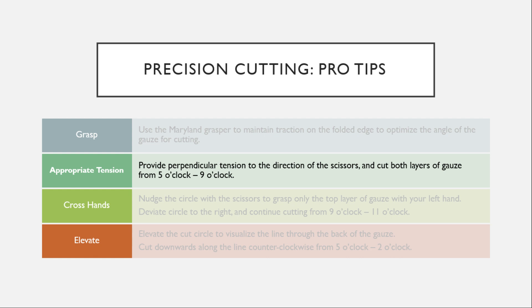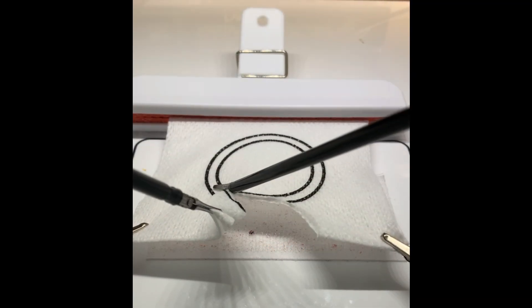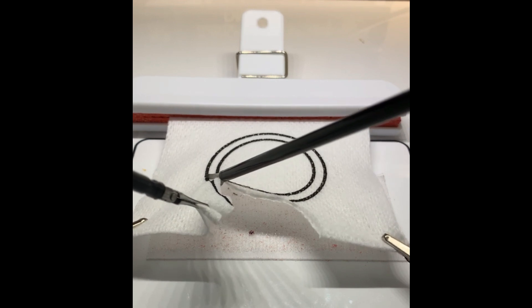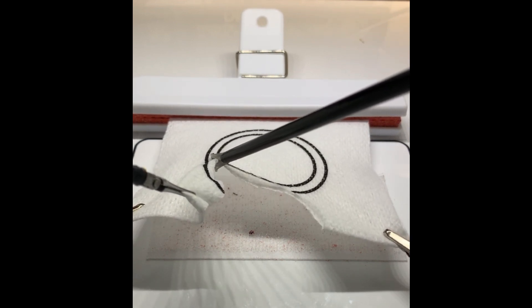First you'll want to provide perpendicular tension to the direction of the scissors and cut both layers of gauze from 5 o'clock to 9 o'clock. Flipping your scissors can help you stay close to the line.